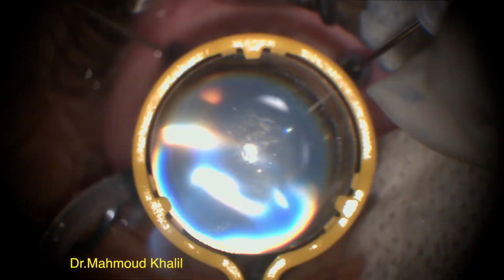Then doing air fluid exchange, aspirating the fluid at first, and after aspiration of the fluid, then going to aspirate the Decaline. Aspirating the Decaline is better to be performed on the nasal side, not to disturb the ILM flaps. Then leaving the eye on just air.